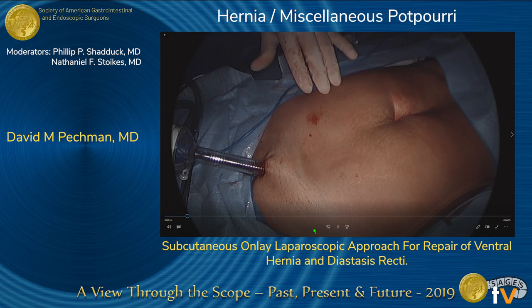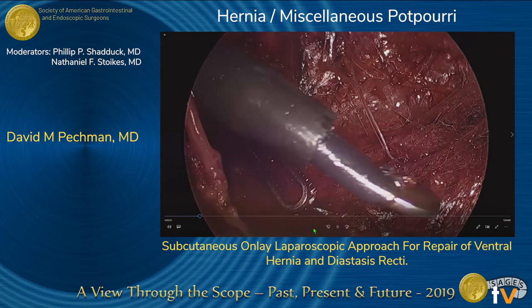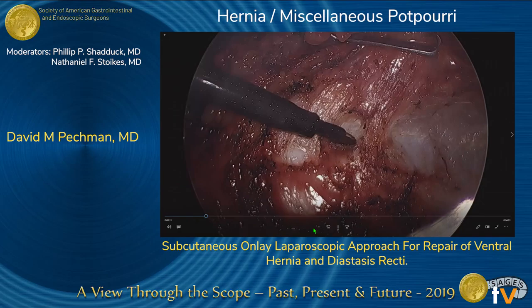A 3-centimeter transverse incision is made 2 centimeters superior to the pubic bone. A 5-millimeter trocar was inserted under direct visualization at the midpoint between the midline and each anterior superior iliac spine. Monopolar electrocautery was used to dissect the anterior rectus sheath from the subcutaneous tissue.